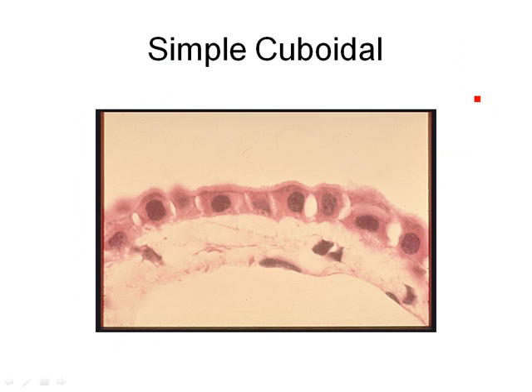Again, this is a picture of simple cuboidal epithelia, but you're looking at it from a different view. And you really can see they're kind of squarular. They're cuboidal. This one also has cilia. These little hair-like structures, these are cilia. And remember, cilia, those little hair-like projections that kind of move and will help move things along a tube.